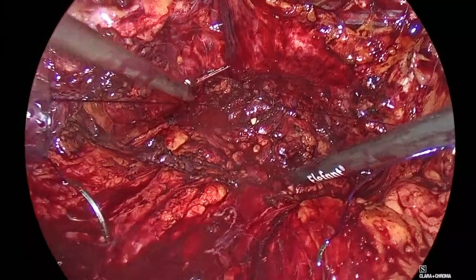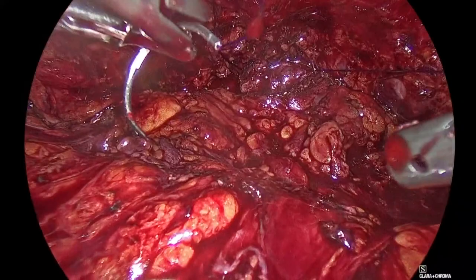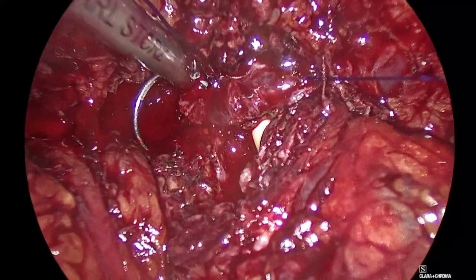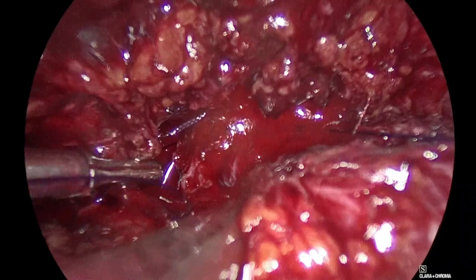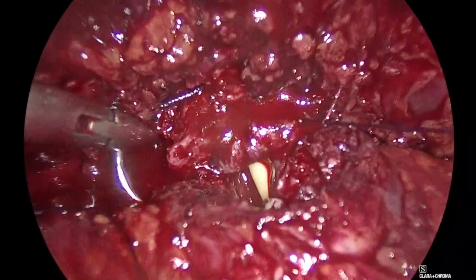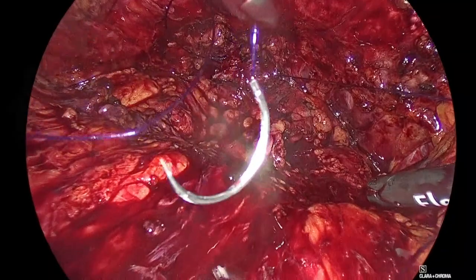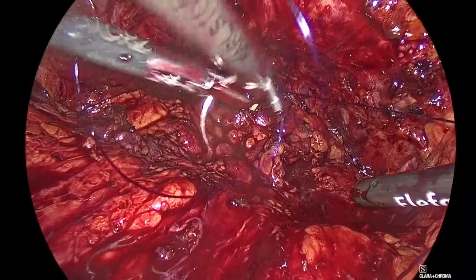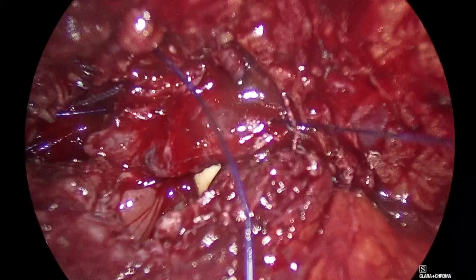Check the catheter, please. Good. Start the irrigation, please. You can increase your irrigation now. Come in. We have something bleeding there, but I will put some tension on the balloon and I think it will stop. Go back. Check. Good. Okay. Let's go in. I'm close. Good.